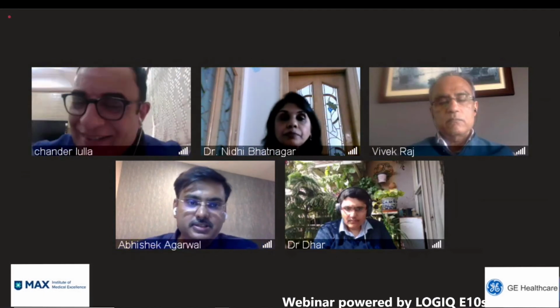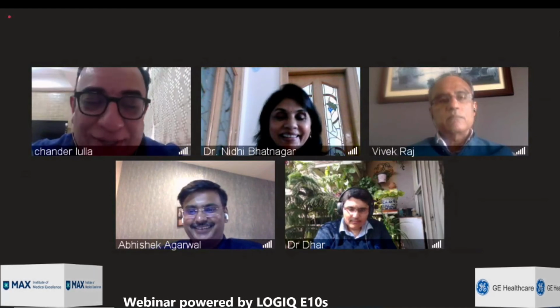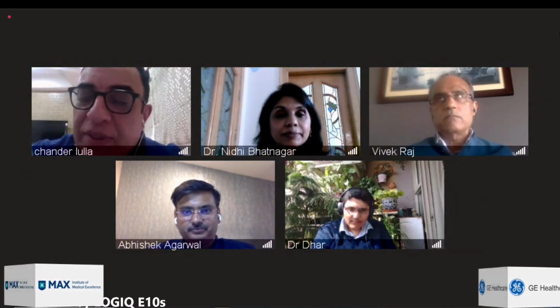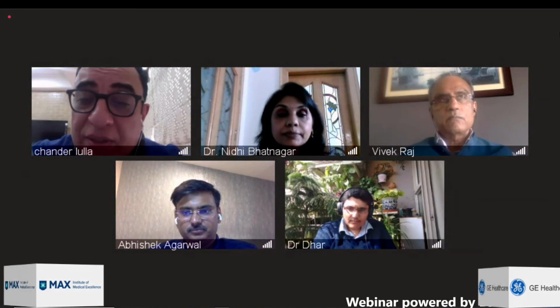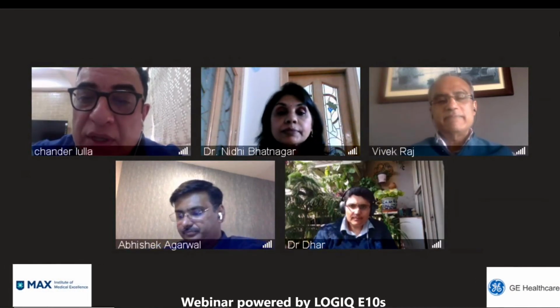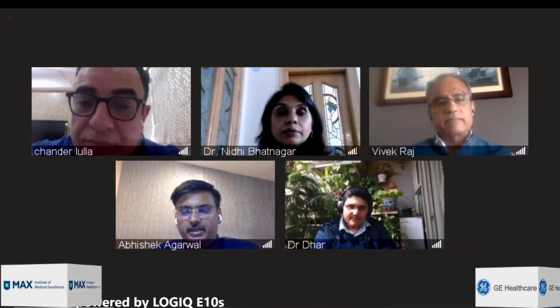No, I use contrast. We need to be very accurate in today's times. We have used elastography earlier, but there's considerable overlap. You can get hemangiomas, which are extremely fibrotic and giving you high values. You can get hepatocellular carcinomas, which are soft. So I think it's not accurate. We need to do contrast ultrasound.